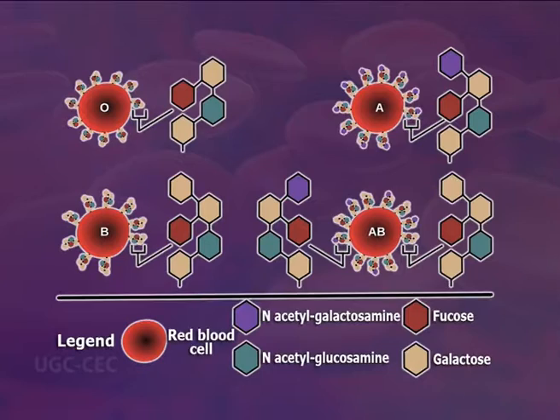Principle: the ABO antigens are primarily glycolipids which are found on the surface of human red blood cells as well as in association with other body tissues. There are two distinct parts to ABO grouping.